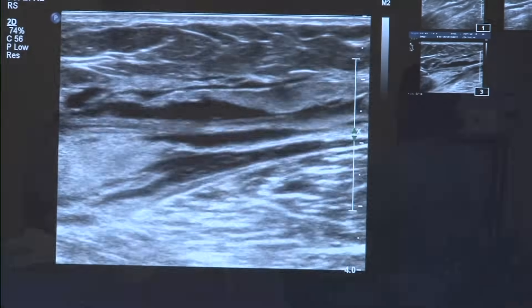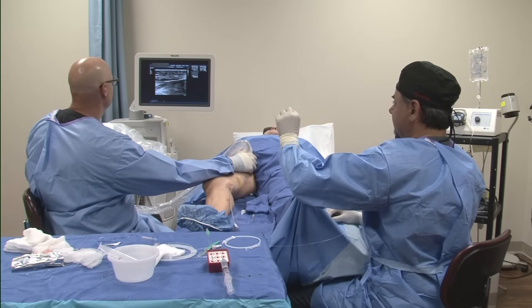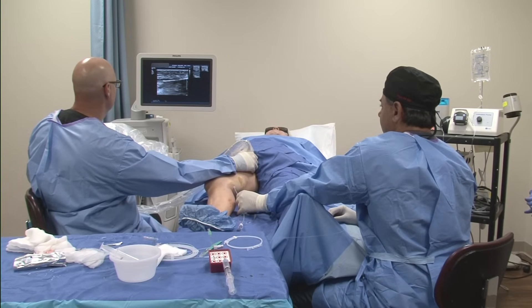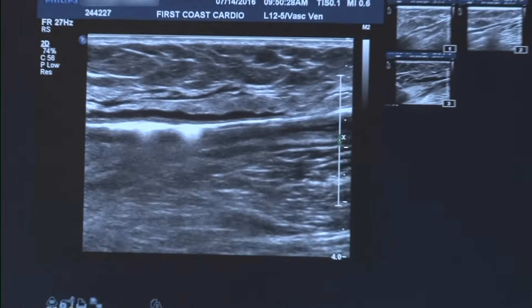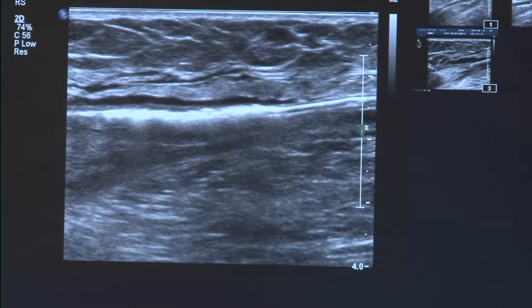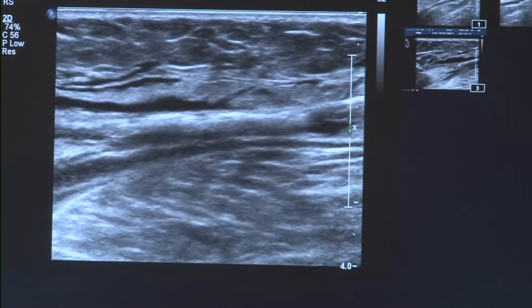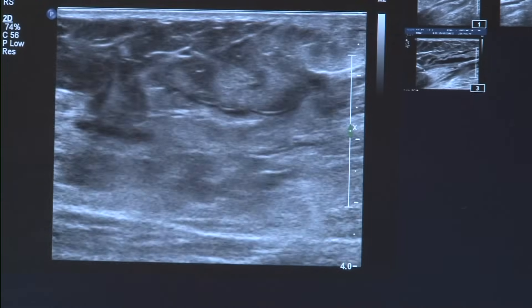We're ready to go. It's very important to see, once I activate the laser, that you can actually see the vein being collapsed behind the catheter. What is happening is denaturation of the protein in the wall of the vein — that's what we're trying to achieve. You can actually see the laser catheter firing and the vein closing right behind the catheter. I'm doing a very nice slow pullback. You can keep a little compression with probe pressure onto the vein to ensure good adherence of the vein onto the catheter — that's what the tumescence does as well.